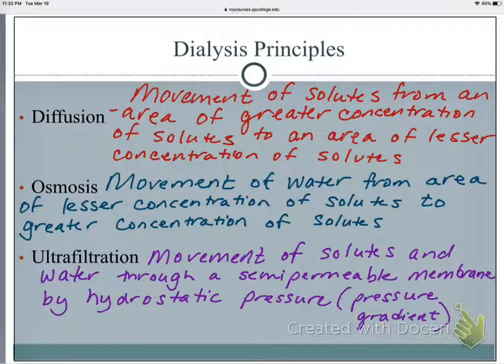They do lose blood, and we'll talk about that with hemodialysis, but that's different. But smaller molecular weight substances can pass through. So they make sure they use quality water and those sorts of things. Okay.